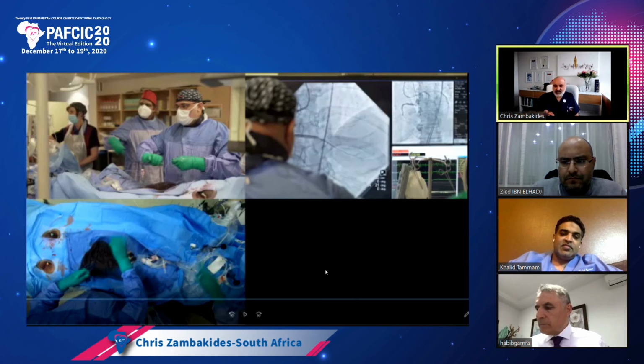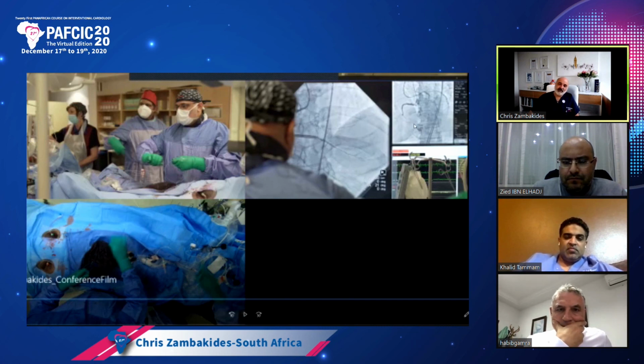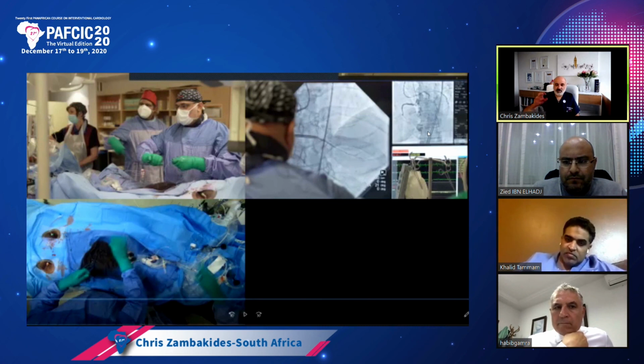As I mentioned there, you can only really connect if both wires are either intraluminal or both in the subintimal space. The other option would have been that if antegradely we got subintimally, then we would have gone a little bit further than the stent, knuckled, and then we would have known that in that space we would both have been in the subintimal space. We would have brought an antegrade balloon and done the reverse cart there. But I think the advantage that we had here, once I knew that we had gone into the stent, I knew that both wires were in the same space.